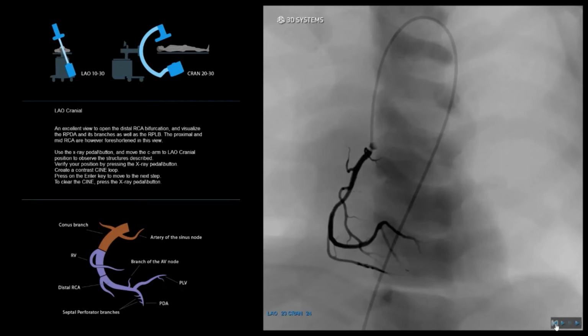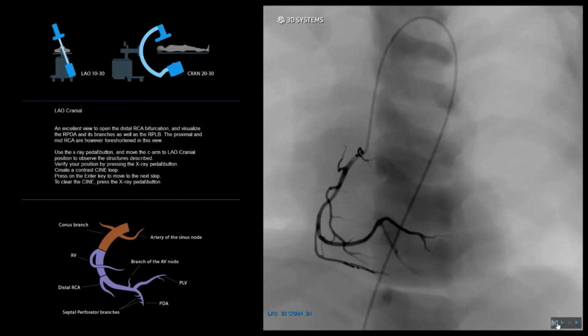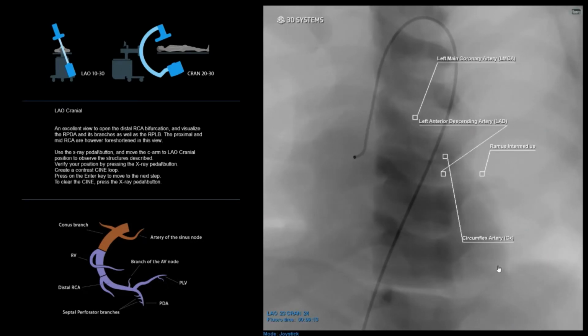That's good. Now show the PLV, Shani, after the bifurcation. And the bottom vessel after the bifurcation is the PDA. Yeah, that's the PDA. And that's the view.